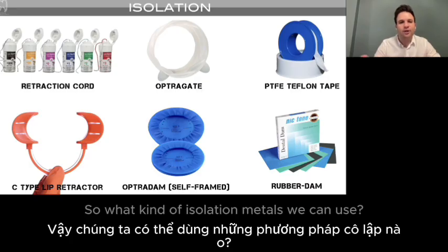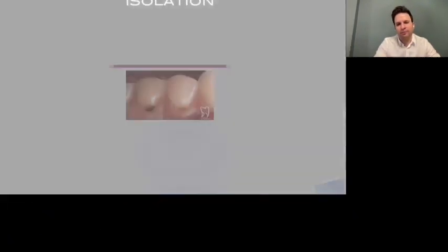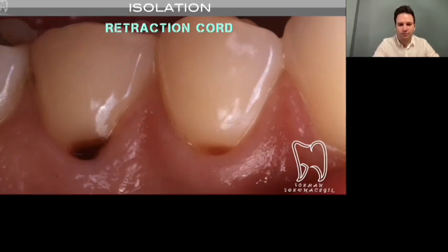So, what kind of isolation methods can we use? It depends on the restoration area. For example, you can use retraction cord for cervical restorations.